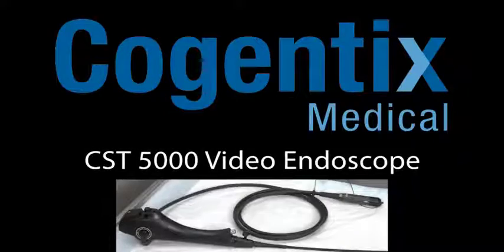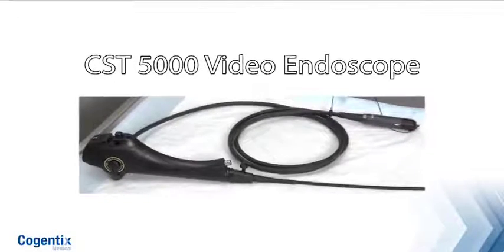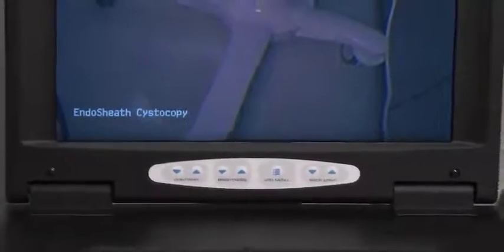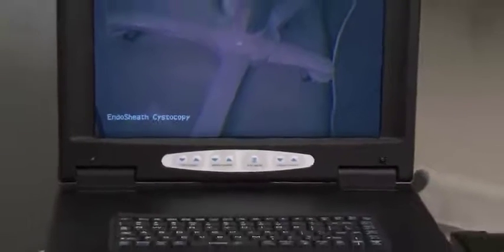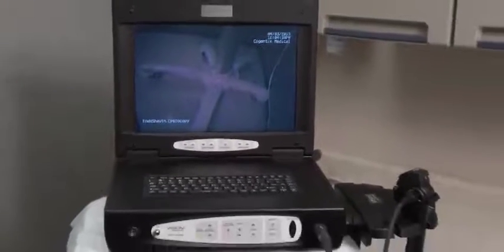Cogentex Medical's CST5000 Flexible Cystoscopy System introduces a powerful and efficient solution for urologists in both their hospitals and private clinic settings, with reliable capabilities and complete functionality for performing traditional cystoscopy procedures and surgeries. The system is designed to help physicians perform safe and effective procedures while providing breakthrough advances that could significantly improve the efficiency of the urology practice.